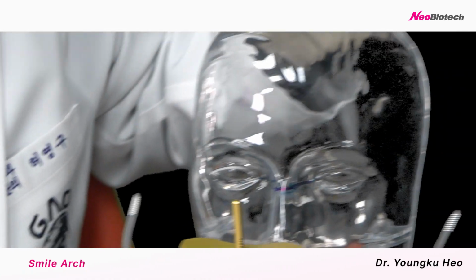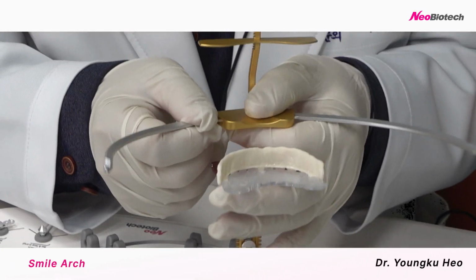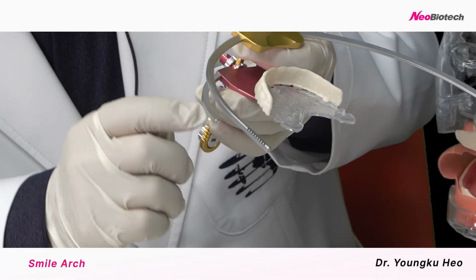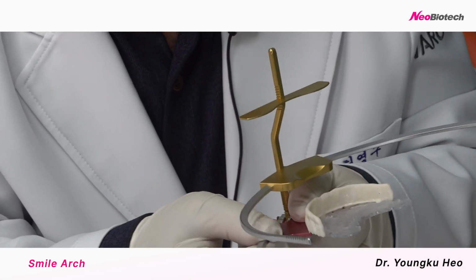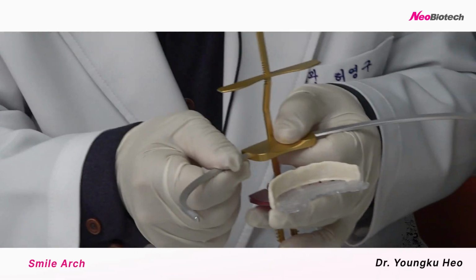All right, so once it is determined, this is the occlusal plane, actually, parallel to this occlusal table. This is just a reference, so you don't have to use this one. You can take it out. All right.